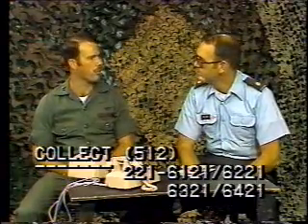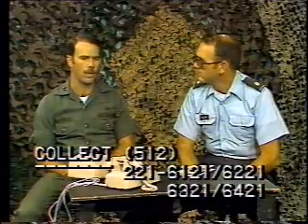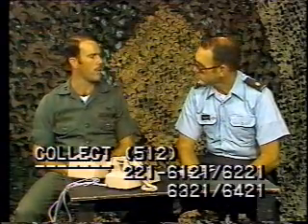Well, you're just going to really have to use your common sense and compensate as best you can. Obviously, we don't have everybody the same height in the Army, so you want to try and space your people out, possibly putting the two tallest at opposite ends so that they can keep it a little bit level. Some of your shorter team members may have to hold the litter up a little bit, and taller team members crouch a little low. But that's a real problem. There's really no way around that.